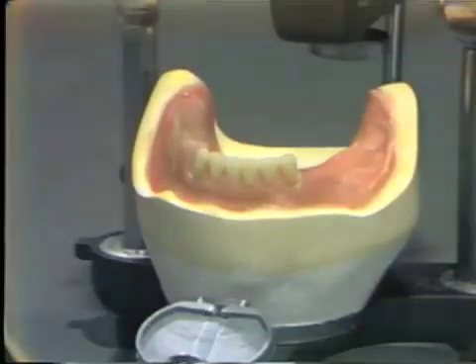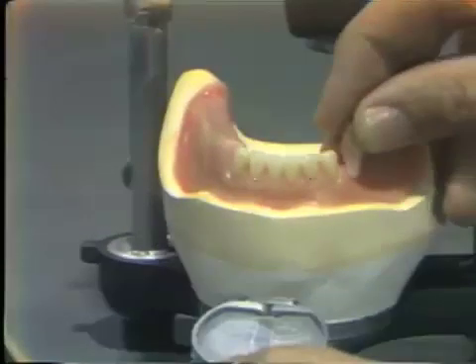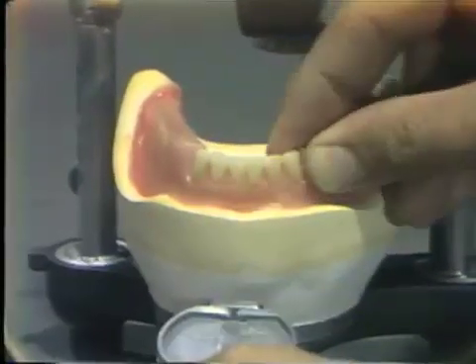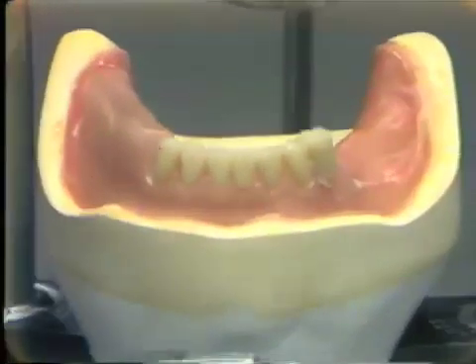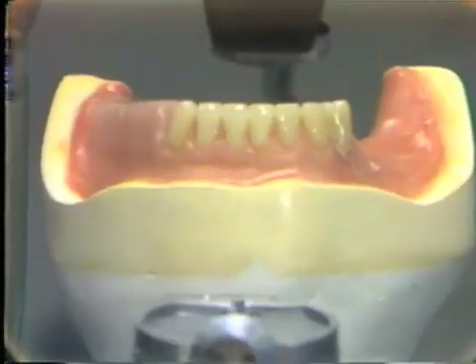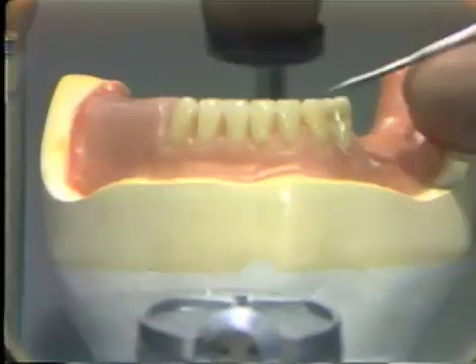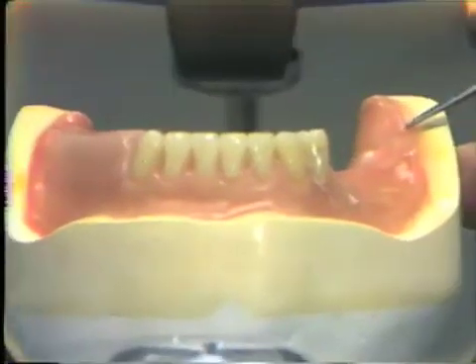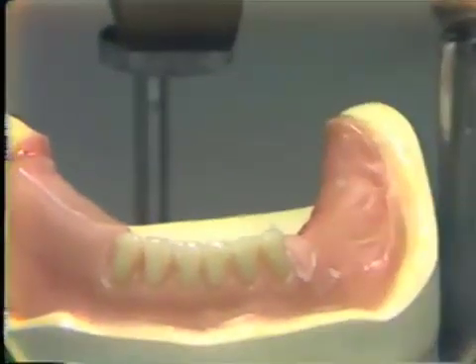The second bicuspid is the tooth we will begin with, and it is usually positioned off the distal of the cuspid and directed towards the retromolar pad. After positioning the tooth, you will notice that it is a little bit too high for the tentative plane of occlusion, coming from the cuspid and moving back to an area approximately two millimeters below the retromolar pad. So I'm going to grind this tooth slightly with a heatless stone and prepare the undersurface of the tooth.